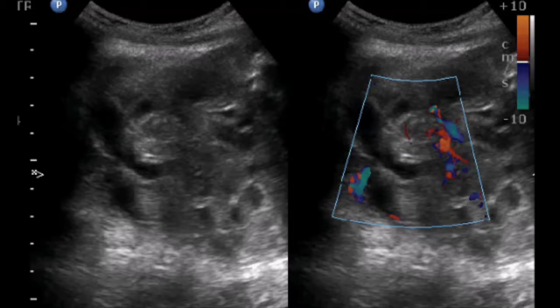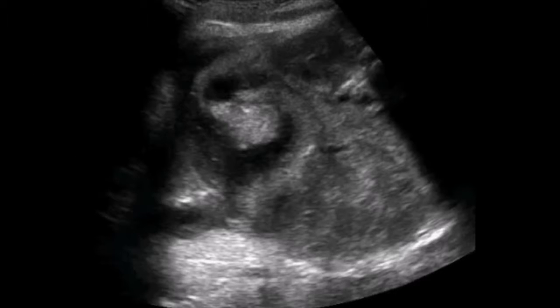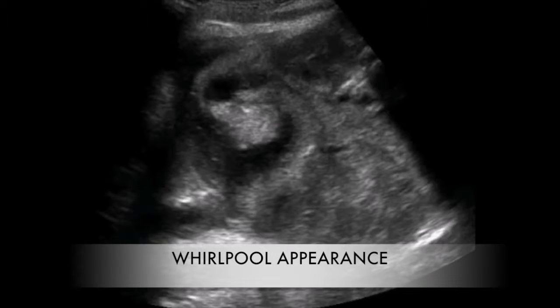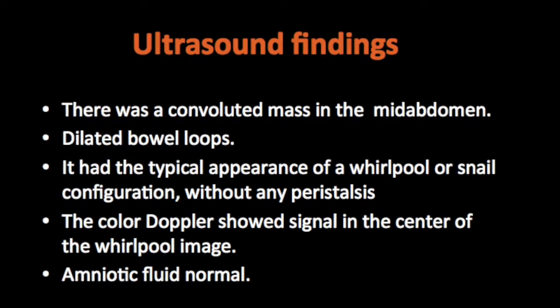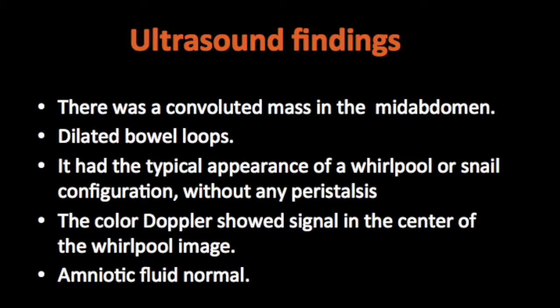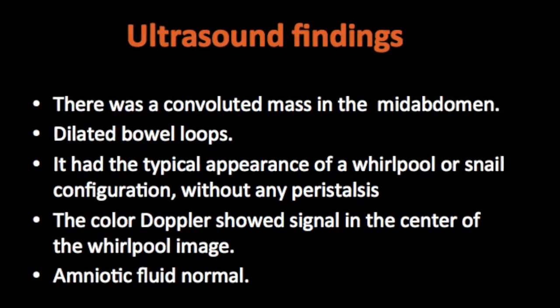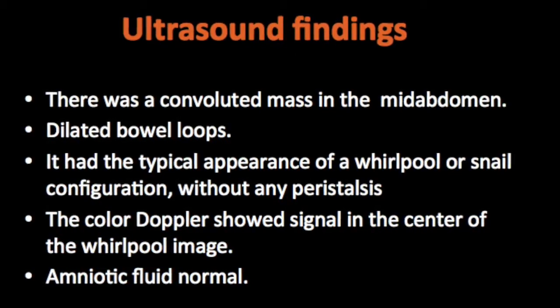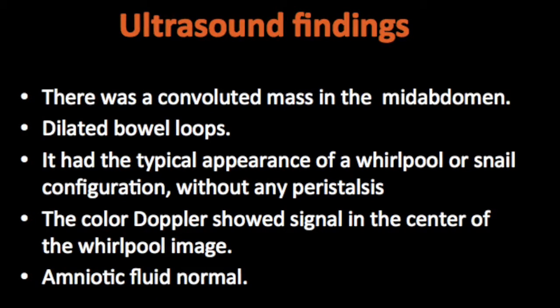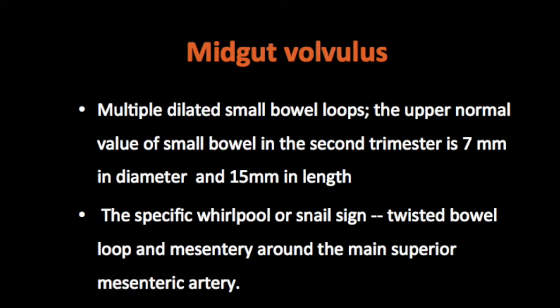So what are the ultrasound findings? There is a convoluted mass in the abdomen. The dilated bowel loops are seen. It shows a typical appearance of a whirlpool or snail configuration without any peristalsis. The colour Doppler showed signal in the center of the whirlpool image, which may indicate that there are less chances of bowel necrosis in this case. The amniotic fluid was normal. So this was a typical case of midgut volvulus.